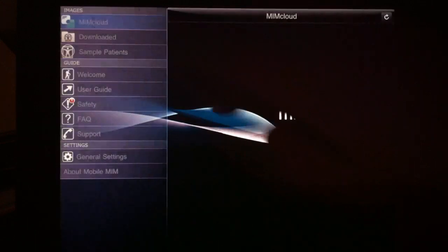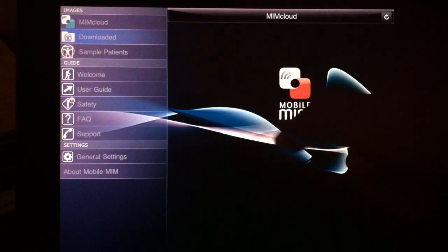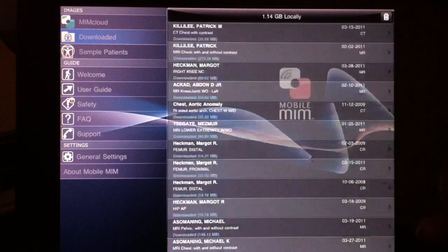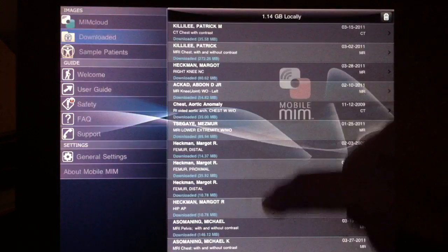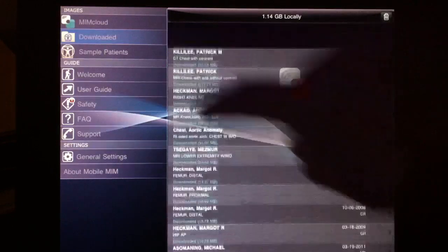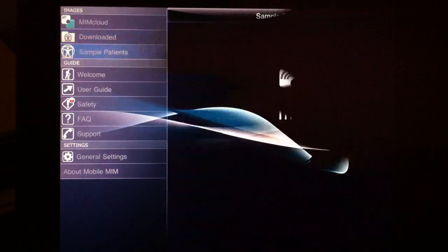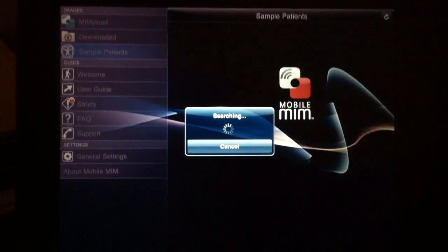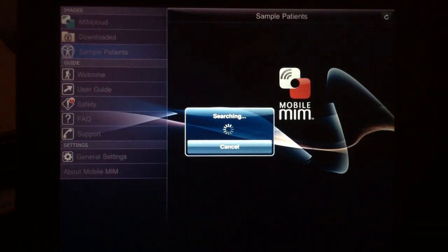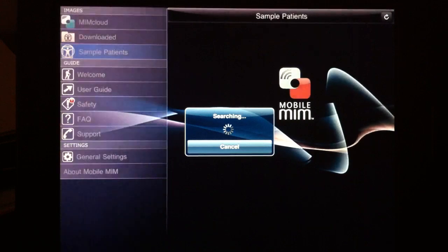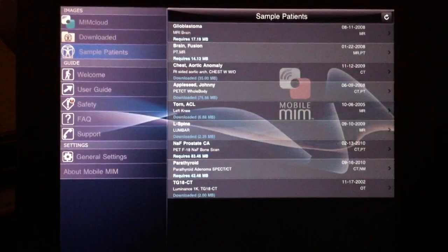The studies that you've already downloaded are available here. As you'll see, they're listed simply by the study type and title and not grouped by patients, which can make it a little bit unwieldy if you have a lot of studies.